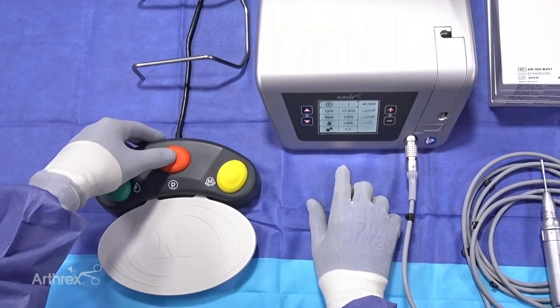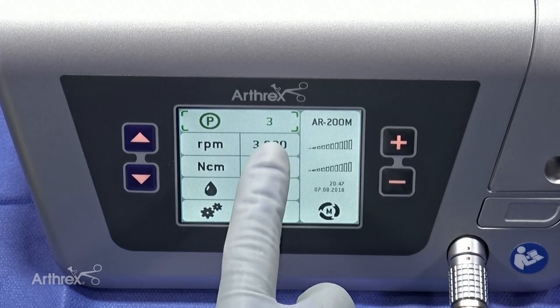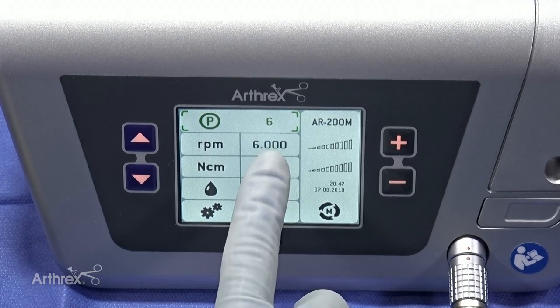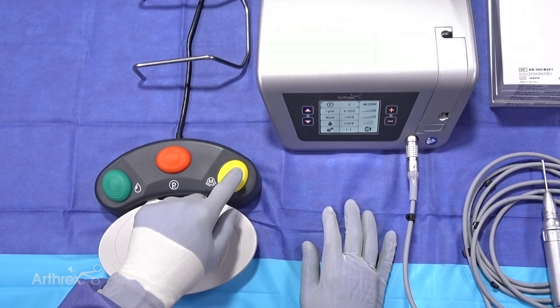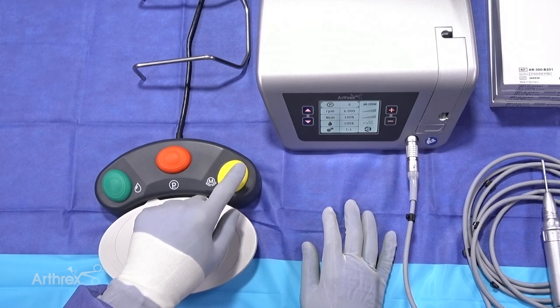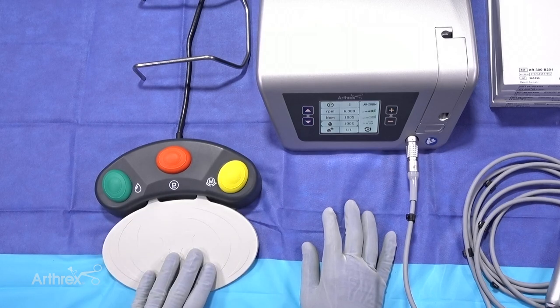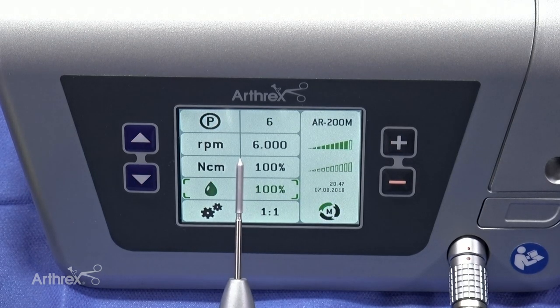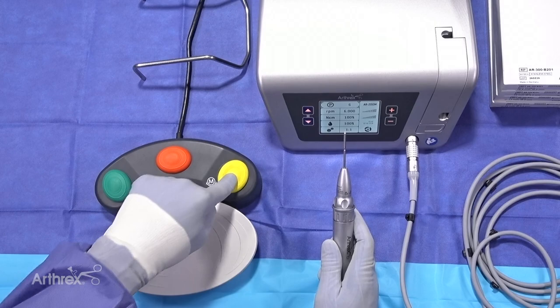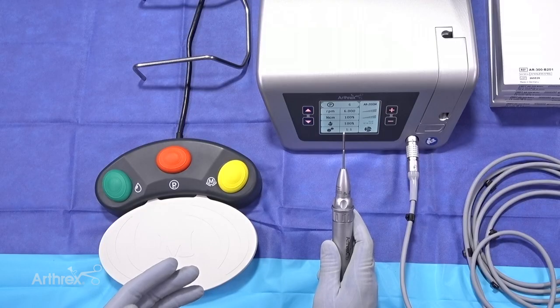The orange button cycles through the different presets, so the surgeon can toggle through them as desired. The yellow button simply adjusts whether or not you want an alarm that beeps every time you use the foot pedal. Most surgeons do not like the alarm, so with the alarm off, I push the foot pedal and the burr spins. When the alarm is turned on, it gives an audible beeping sound to indicate that the burr has started, and it will delay.